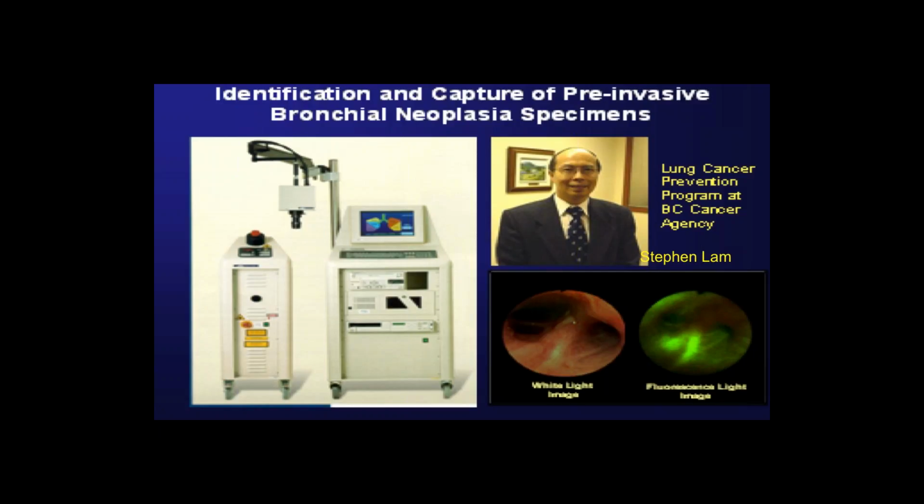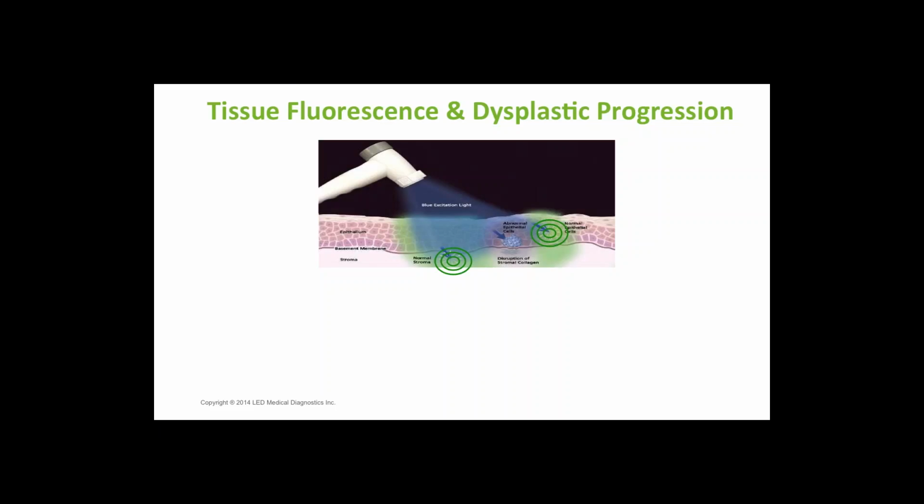That's one thing about medicine that's pretty common. If you see an impact, especially when it comes to cancer, it gets adopted fairly quickly. Now, it probably isn't used as readily today because you have CT scans and so forth, but it is proven and well studied. Taking this technology, we developed something that could be utilized for the oral cavity.